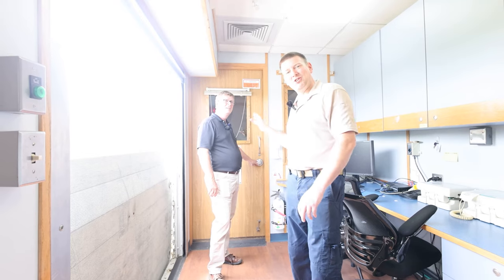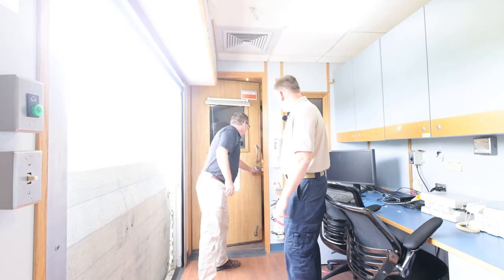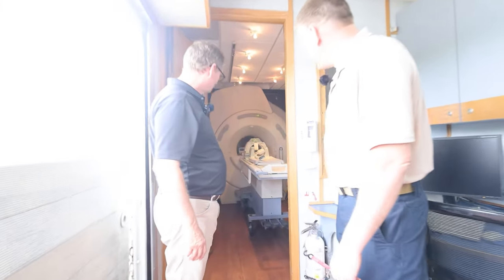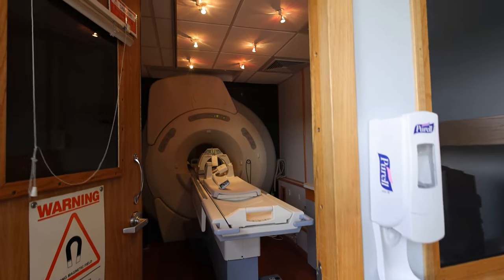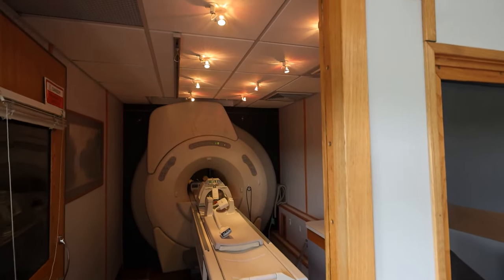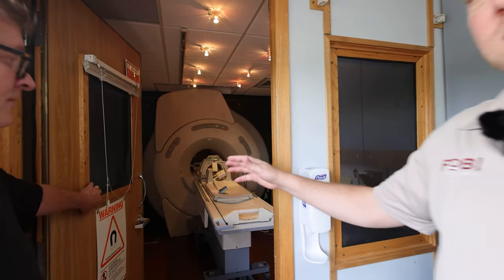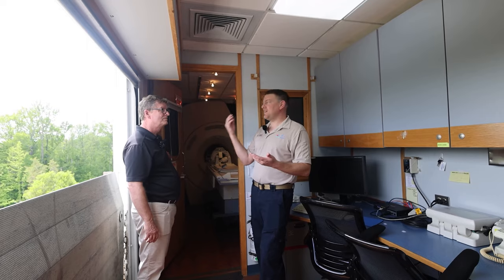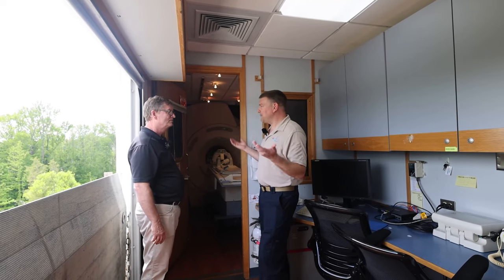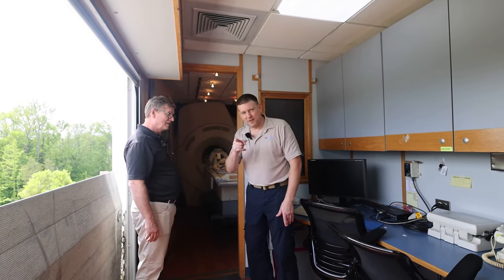I can hear that characteristic chiller, that shoo, shoo. Oh yeah. So I'm gonna go ahead and open this door because it's the only way you're gonna be able to see it. Yep, there it is, that's the sound. Oh wow, it feels good in there, nice and cool. I cannot believe that you guys fit this inside a trailer. You see how tight it is? And a lot of the work is done from the back of the trailer. There's a door or a hatch back there. So it's actually very cool in here, not only because we got helium and a chiller that we've got to worry about, but for staff convenience, that's one of the things I would always worry about with a trailer, that it's going to be hot and stuffy in there. It actually feels just like a hospital environment. Oh, they're all very cool because of the equipment. Very cool, physically and metaphorically.